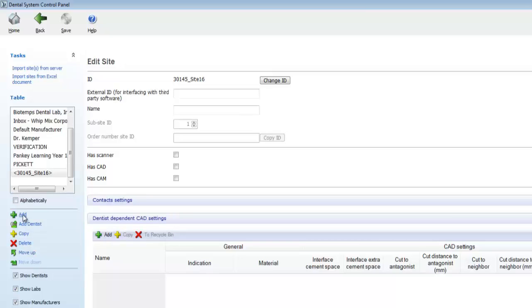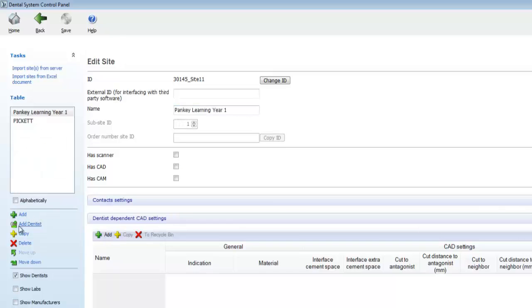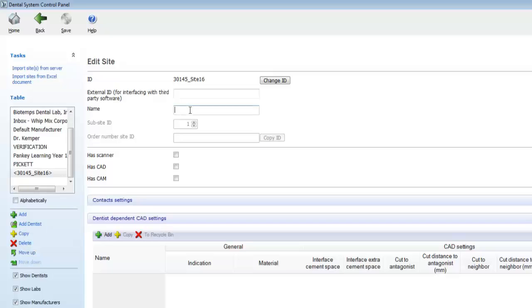To add a lab, we simply just press the add text next to the plus sign. We can add a doctor by clicking the add dentist text. After we've added the lab, we need to type in a name for it. We can do this by typing the name into the user input box named name.